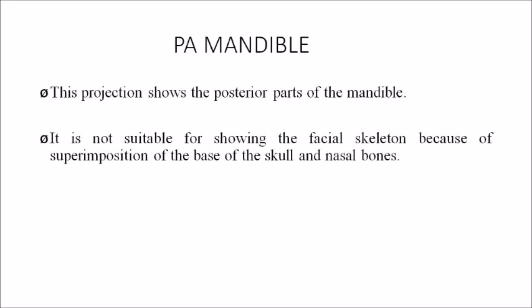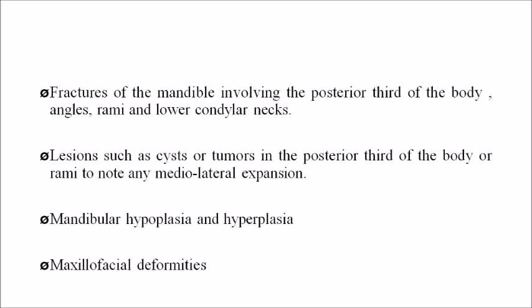The PA view has a modification specifically for the posterior parts of the mandible. It is not suitable for showing the facial skeleton because of superimposition of the base of the skull and the nasal bones. It is used for fractures of the mandible involving the posterior third of the body, angle, ramus, and lower condylar necks, and for lesions such as cysts or tumors in the posterior third of the body or ramus. Also used for mandibular hyperplasia and maxillofacial deformities.